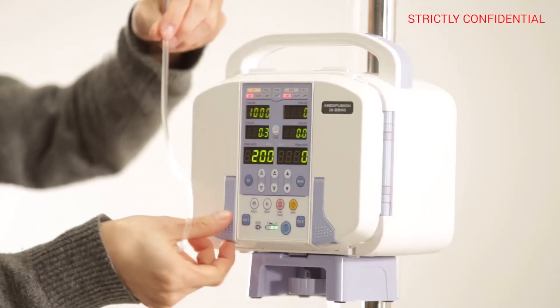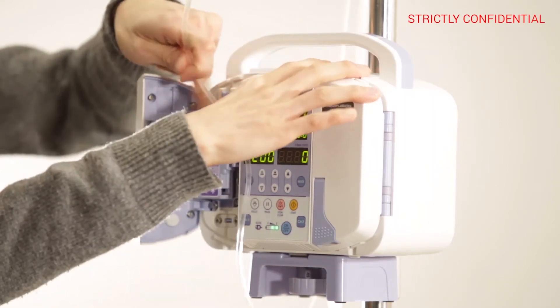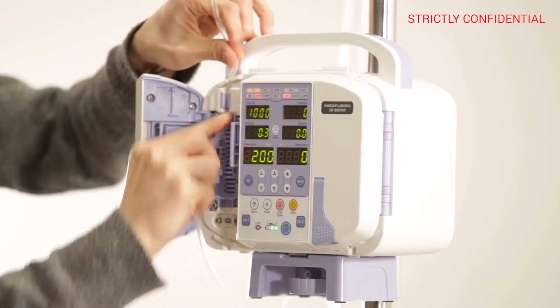Open the main door in the front by using the door handle. After opening the sub-door, load the I-V-SET deeply from top to bottom to install.